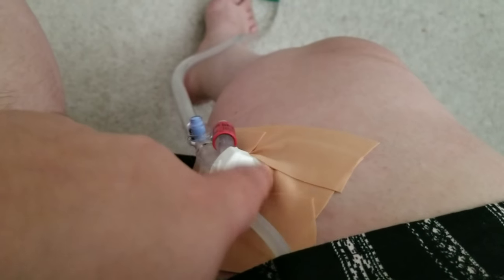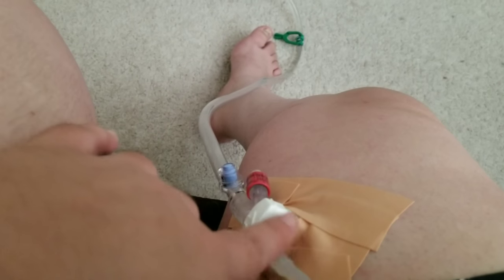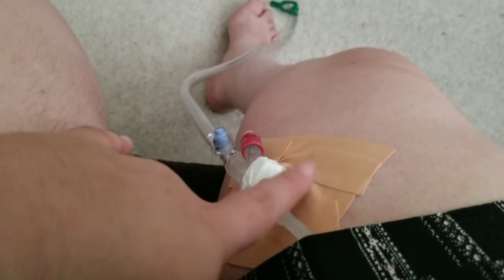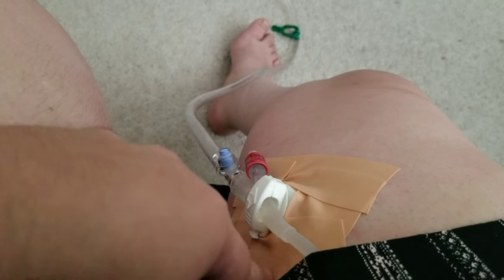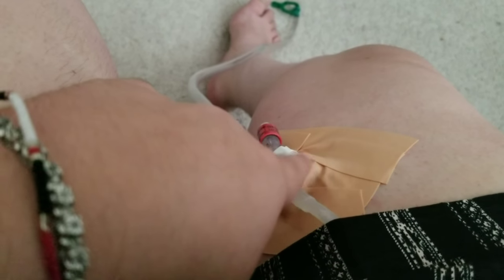Hey guys, so remember I told you guys I had the catheter? So new thing — remember I told you guys I needed to learn how to shower? Here's the reason. Let me flip the camera. So this right here, underneath all this tape, there's like a patch, and this part is the part that can't get wet. The tubing itself can, but this white part cannot for whatever reason. And underneath this, there's a patch that says to remove it with alcohol — that patch cannot get wet either. So I bought this waterproof tape.